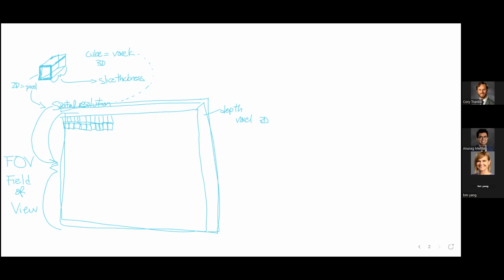So in the axial plane, remember when you look at these images, we'll go back in a second, the patient's body is here. This is the right side. You say, well, wait a minute, that doesn't make sense, that's the left side of the screen, but the feet are coming out towards you.